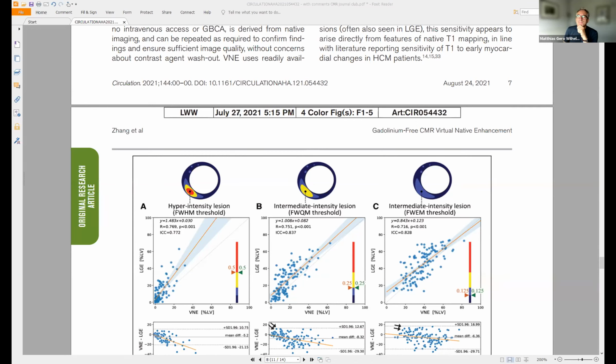Okay, all right. Yeah, so another fellow and I looked at the 345 pairs of testing data sets. We looked at them individually, independently of each other, to see specifically whether the VNE would have introduced a false positive, introduced a blob when there wasn't any, or missed any. And we didn't find anything like that.